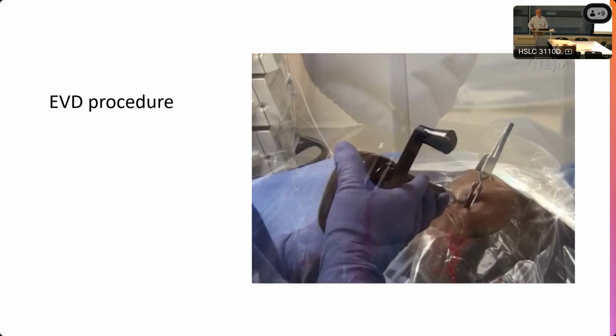Oh, do they have some sort of stop with them? Yeah. And I think we only got those because of a supply chain issue. But apparently the Codman kit, I was talking to Alec recently about trying to give these out so that everyone knows how to use the twist drill. One place discontinued it, so they're working on other ones. We had the Steps kit for a while because it had a twist drill in it, which is fine, but the kit's not as good, so you're wasting all the other steps.